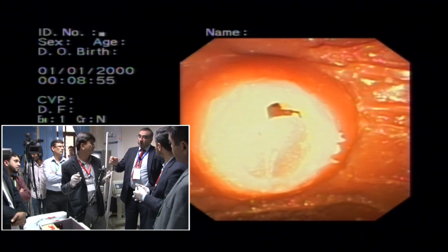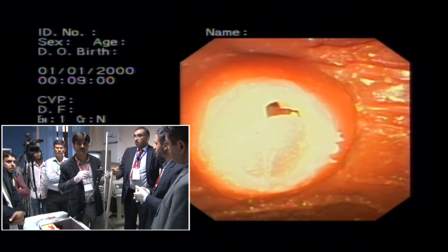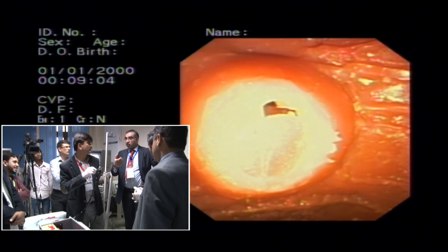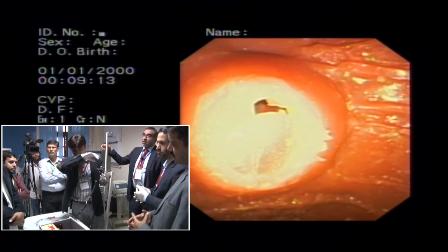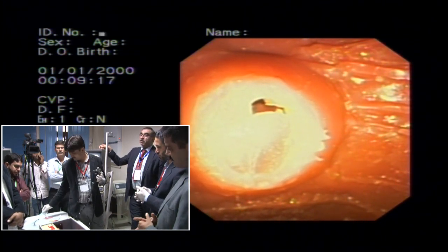बाज वक्त अगर आपकी position unstable हो तो even ये up and down जो होता है ना वो भी आप lock कर देते हो। लेकिन उसमें फिर आपको दिक्कत ये होती है कि movements करने होते हैं, खासकर जब आप stent डालना हो या कुछ करना हो, तो उसमें फिर आपको problem होगी, तो उस वक्त फिर unlock कर दिया करें। लेकिन अगर cannulation में आपको problem हो तो उस वक्त it's quite acceptable to lock it.